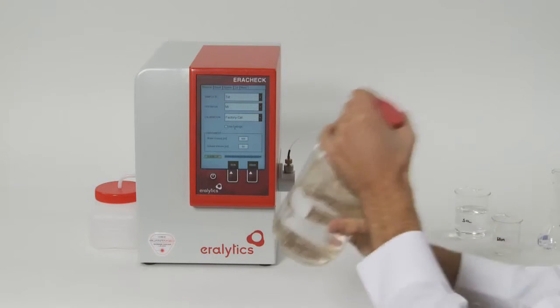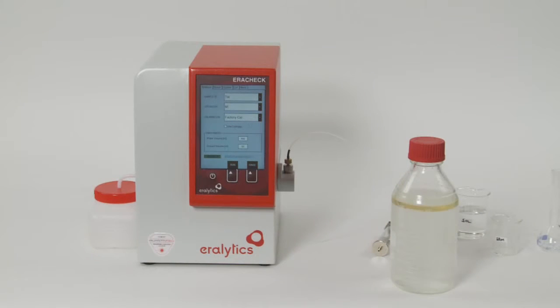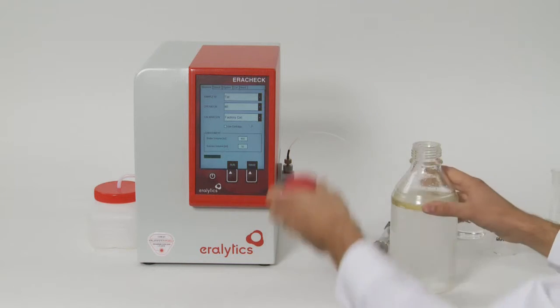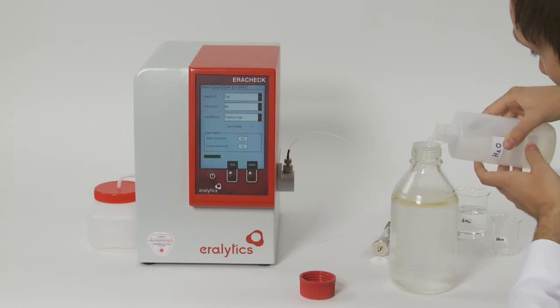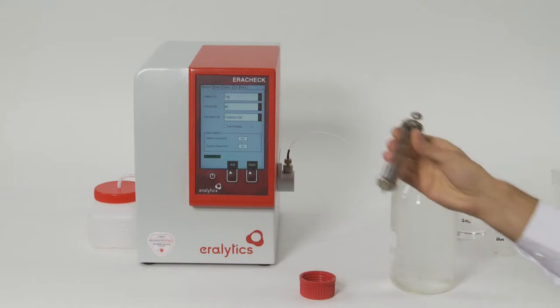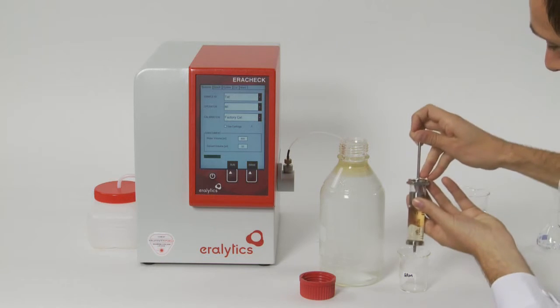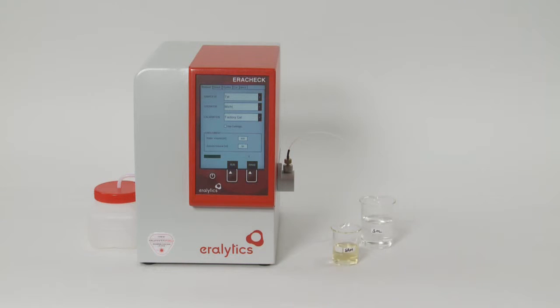Shake the bottle vigorously for a good extraction, then wait until the phase separation has completed. The hydrocarbons previously present in the water sample are now concentrated in the solvent phase. Add some tap water to lift the solvent phase to the top of the bottle, then use the delivered glass syringe to transfer approximately 20 millilitres of the top layer into a beaker glass. The extracted sample is now ready for automatic analysis.